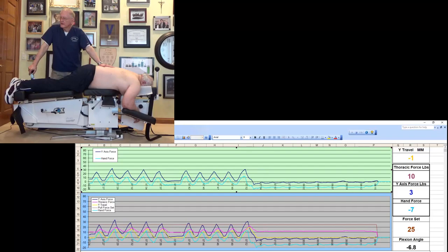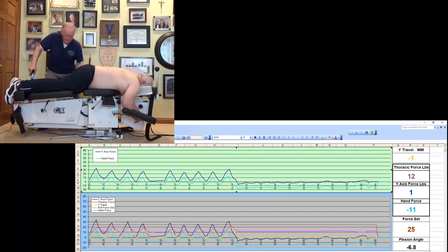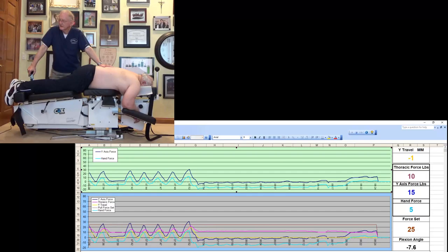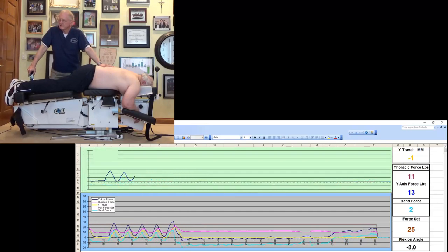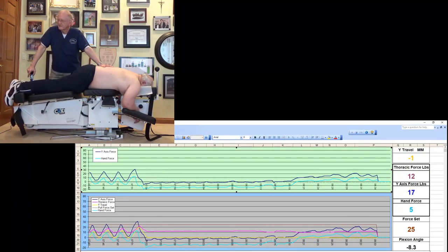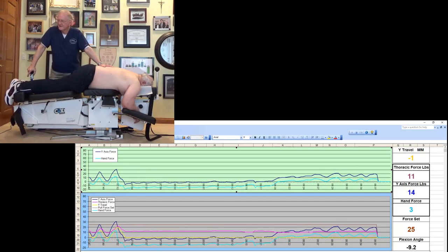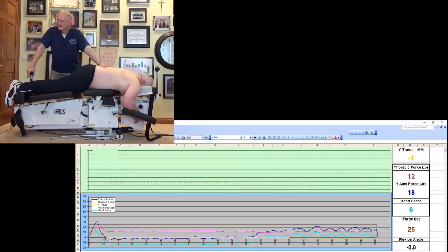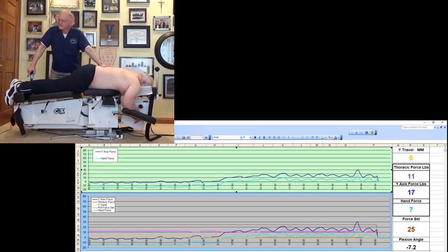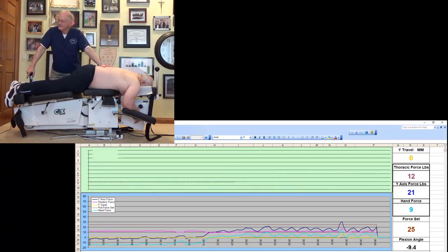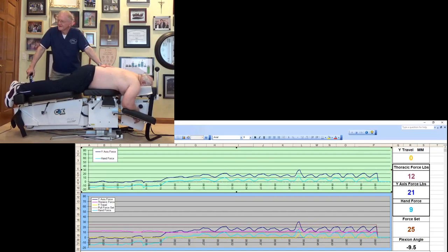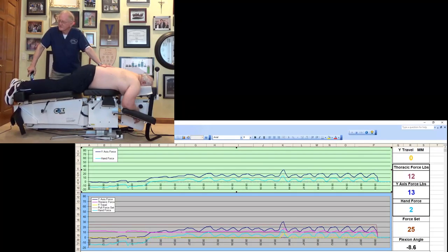Contact L4. I start out manually at two pounds. Taut point, two pounds. Then as the patient tolerates that, I'll move to four pounds. Four pounds. Then I'll move to six pounds. You okay, Rick? All right. I always ask patients, now here's eight pounds. Four pounds. And note the height of the sine wave now. Patient will tell you that's quite a bit more force, okay? That's eight pounds of distraction force.